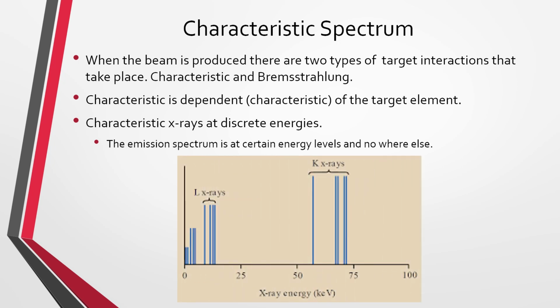And this is a picture of it. So we know that the K energies, when the K shell gets knocked out, and an upper shell electron replaces it, and the photon gets produced in that interaction, and those events, these are the energies of the K shell, L shell, and so forth. The K shell is the only shell that we're interested in, right?